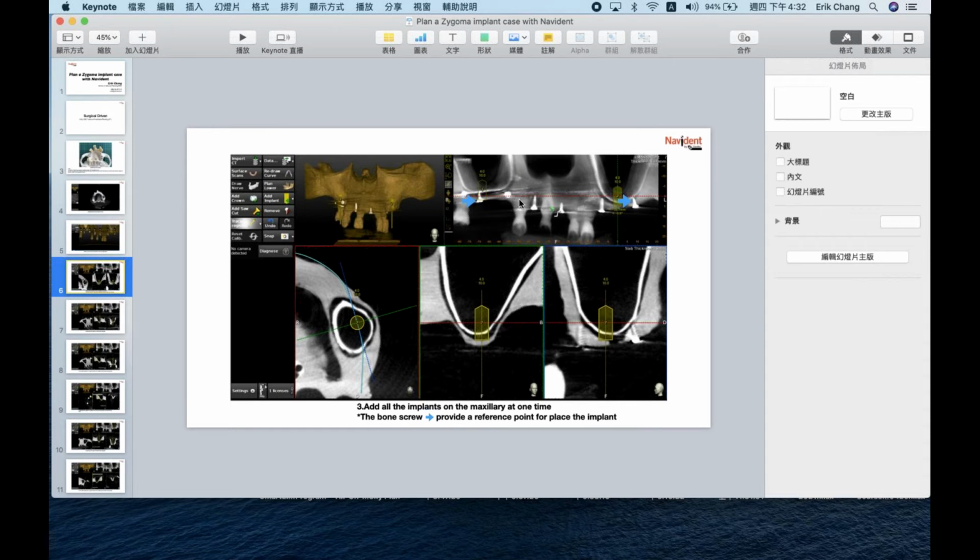But in version 3.0 or 3.0.1, I only do it once to mark the jaw curve, because we changed the offset to 15 millimeters. Yep. Okay. And before I place the implant, I make sure of all the landmarks to decide which one I will use for the tracing purpose.